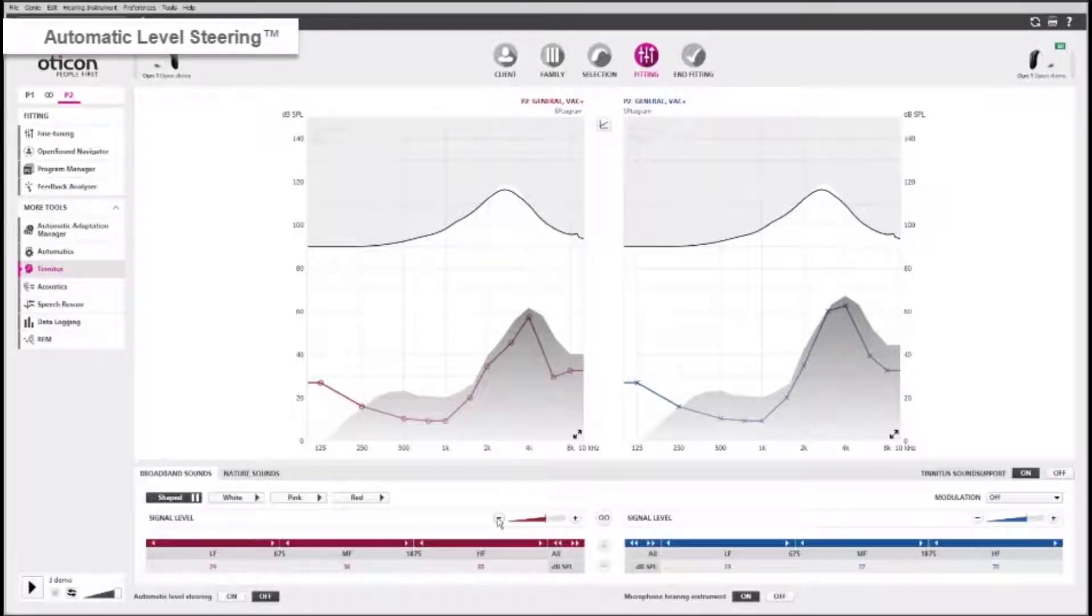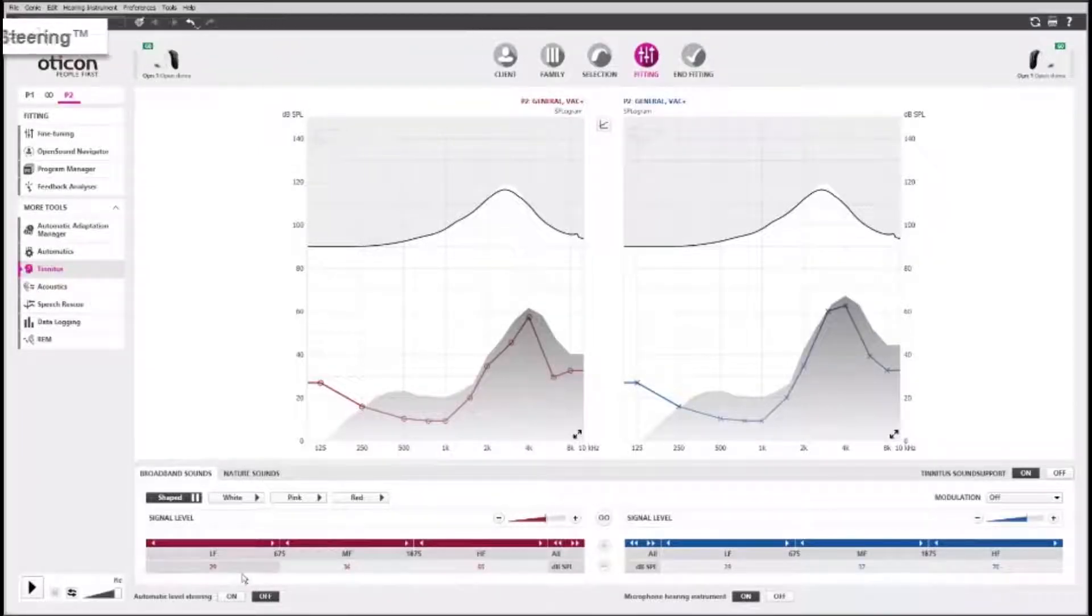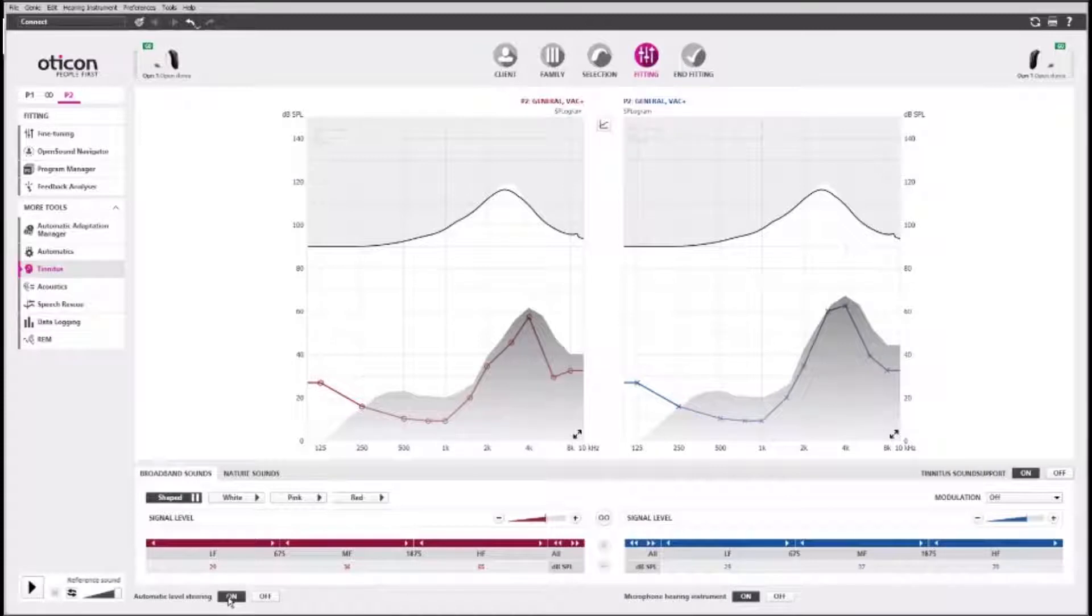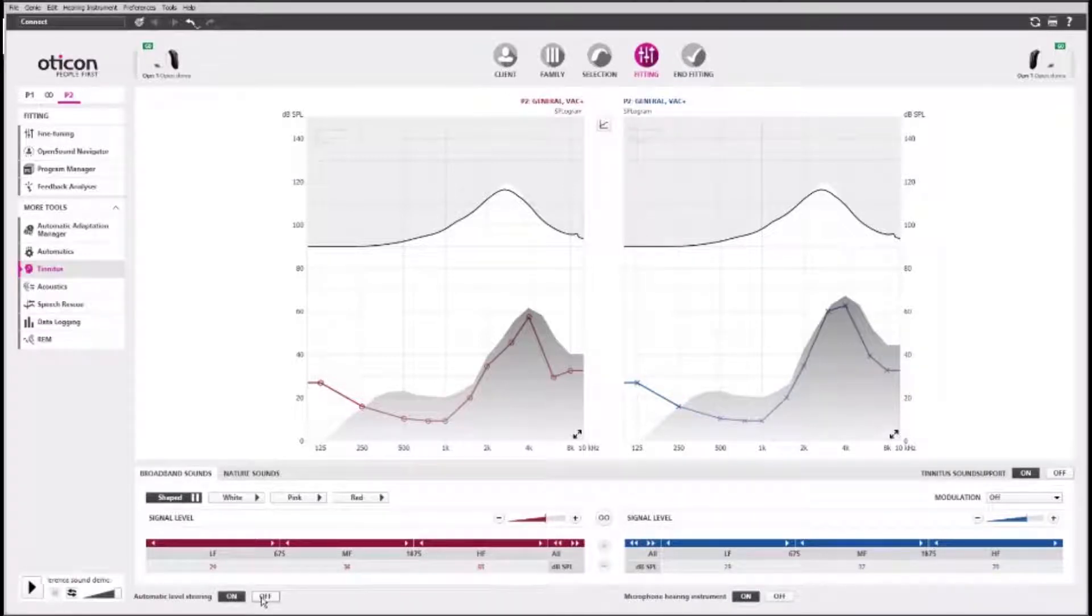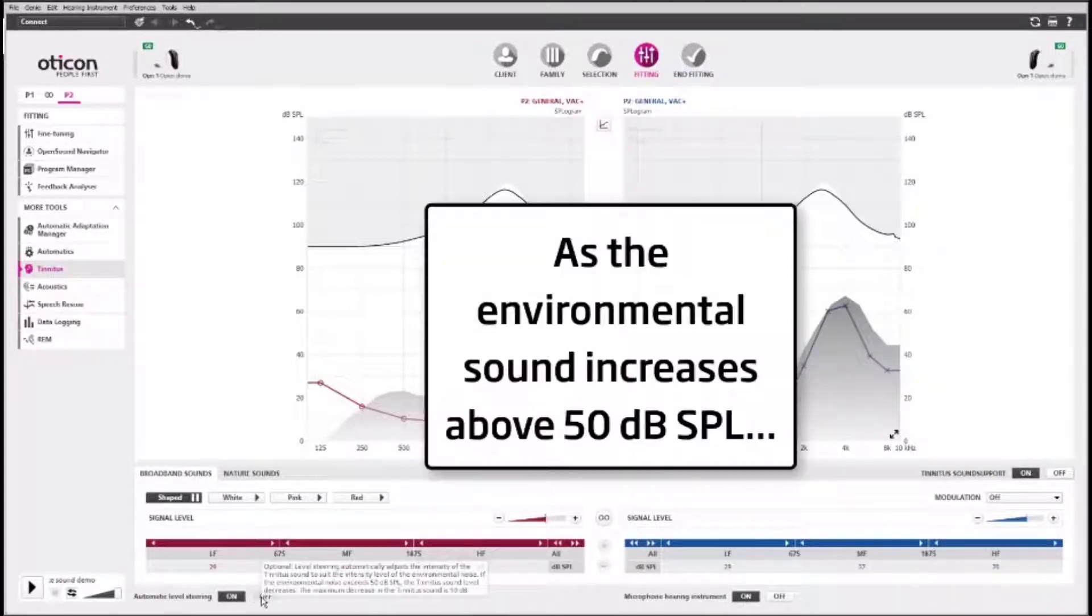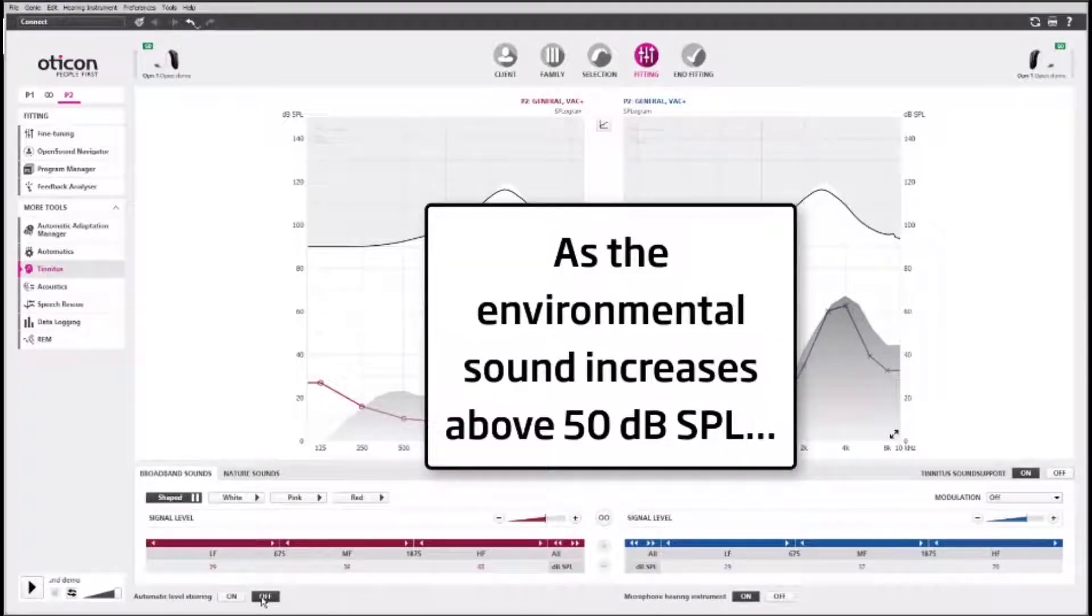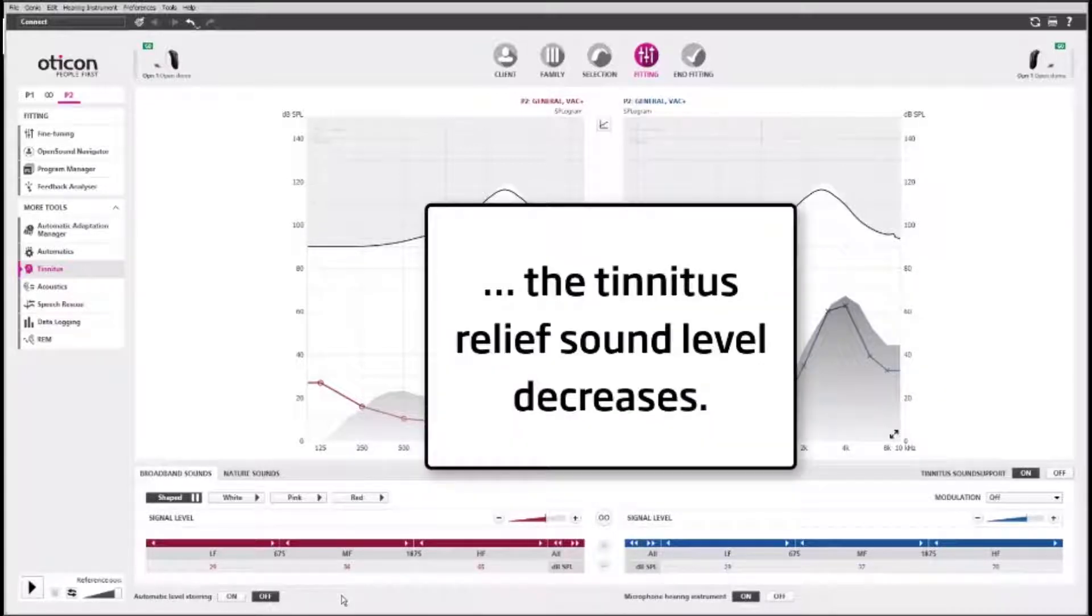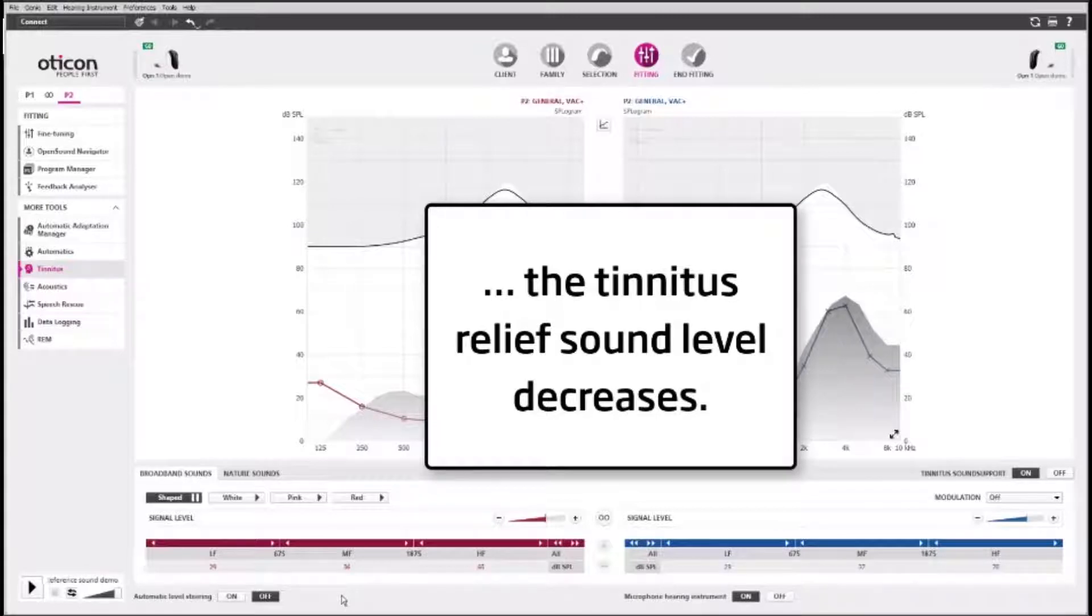The automatic level steering adjusts the intensity of the Tinnitus Relief Sound automatically in response to the environmental sound. As the environmental sound increases above 50 dB SPL, the Tinnitus Relief Sound level decreases.